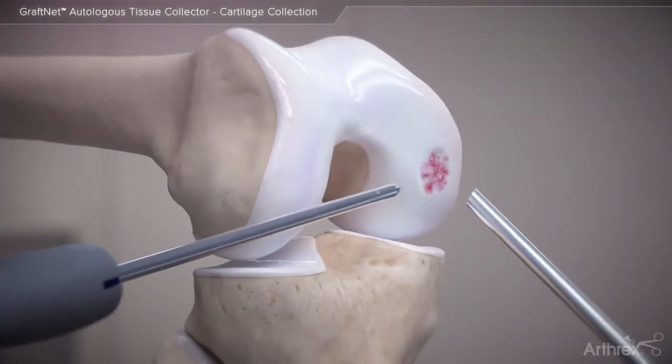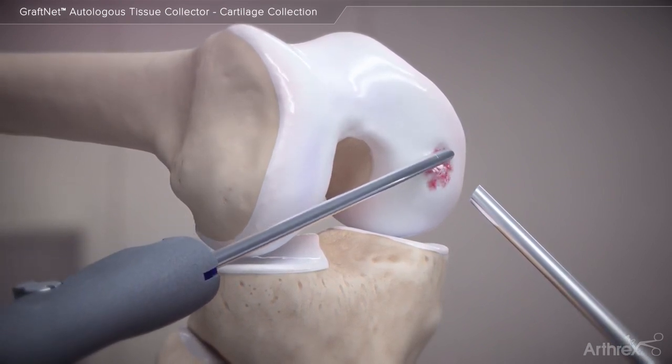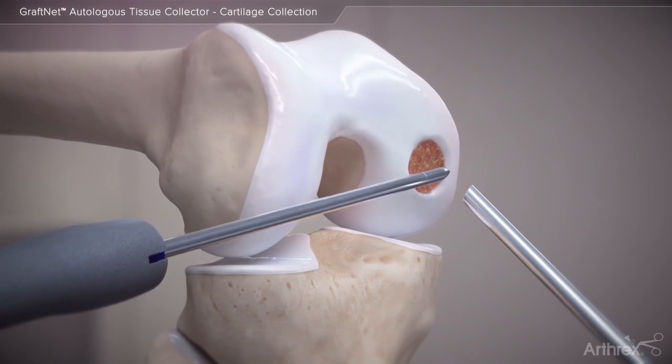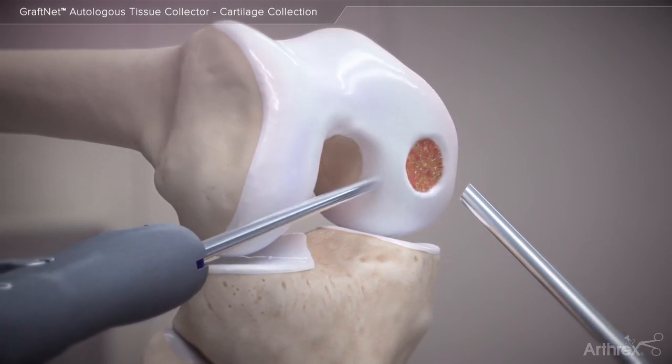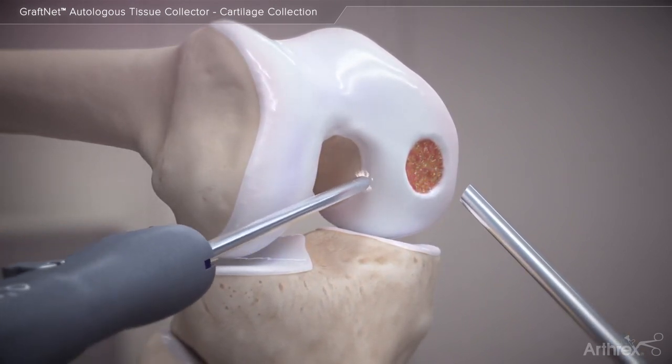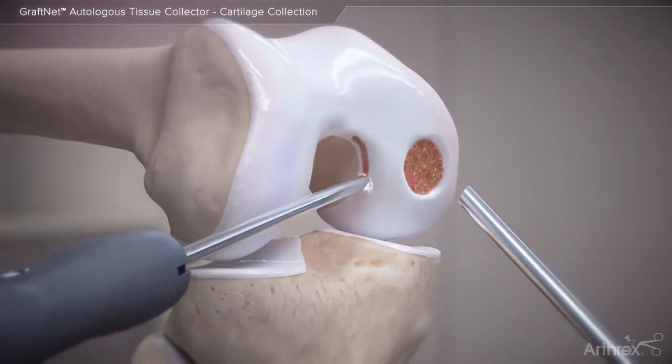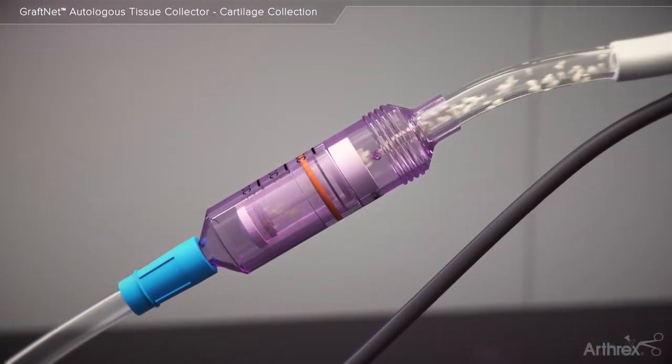To treat an articular cartilage defect, the GrafNet device may be used to collect autologous tissue from the defect site during preparation of the lesion using a shaver on oscillate mode. Alternatively, autologous tissue may be collected from non-weight-bearing aspects of the knee, such as the notch or lateral trochlea.